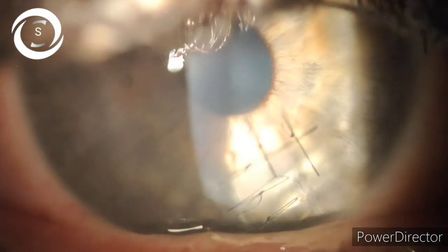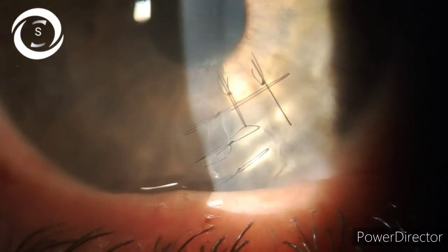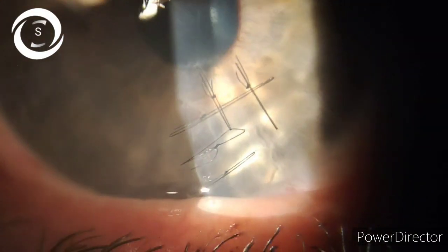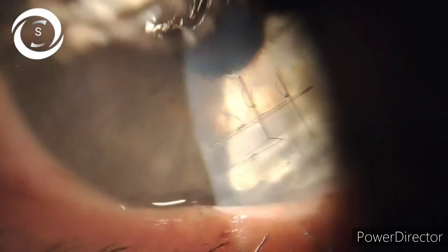So hopefully when we remove the stitches after two months, no one will be able to recognize the corneal trauma this patient had. It was a good case, so I thought I should share with you. Thank you very much.